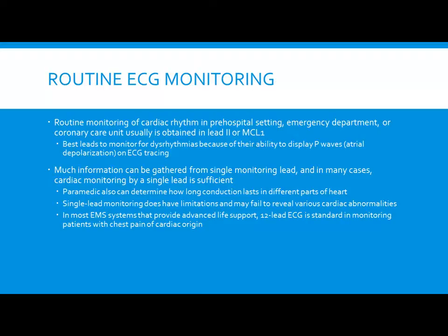A 12 lead ECG is going to be a standard that you do with monitoring if you've got chest pain, shortness of breath, things like that. And so you need to get used to putting a 12 lead on, but as far as interpreting goes, that'll come in April when we go over it, okay?